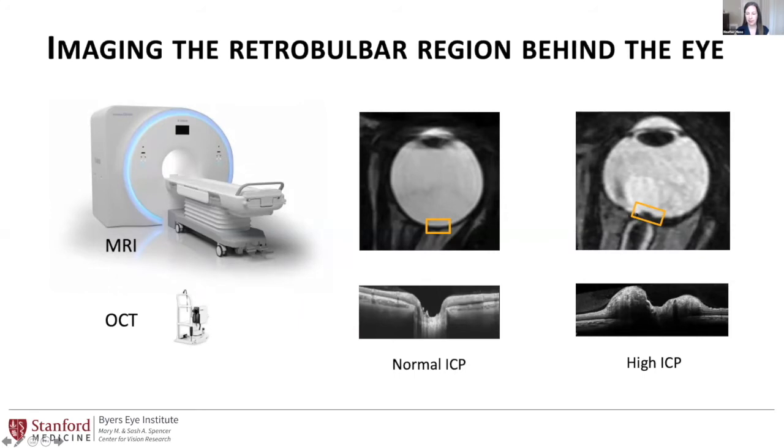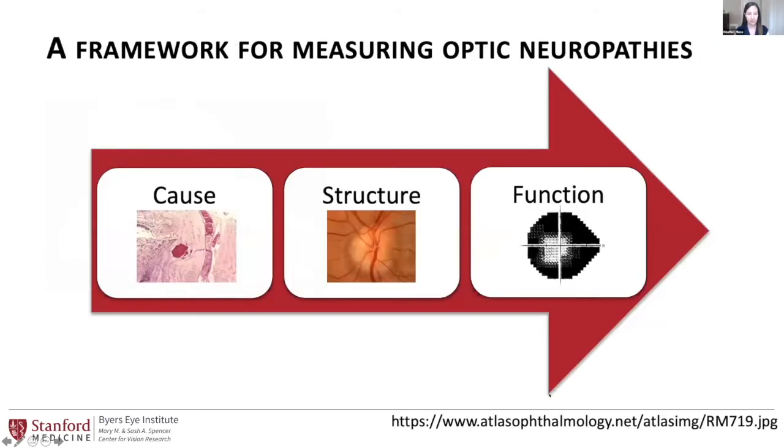And particularly here in an eye with papilledema, you can see the cerebral spinal fluid space, which is where the pressure builds up. You can see the structure of the eye, you can see the lens, you can see the muscles that surround the eye. But the trade-off here is resolution. So even with the best MRI, we're getting resolution at about 0.5 millimeter. And 0.5 millimeter is still 500 microns. And remember I said that we're getting measurements on the order of 10 microns with OCT. And so shown approximately in these yellow boxes is the area and the detail that we're able to get in OCT. And so perhaps the real option is to have multimodality images where you're looking at different things together.